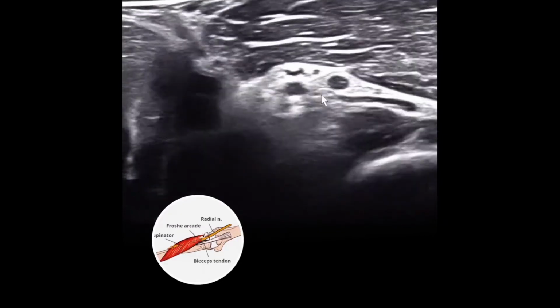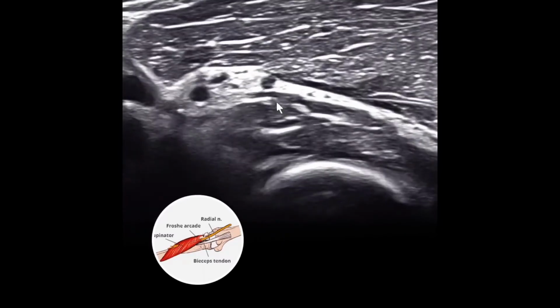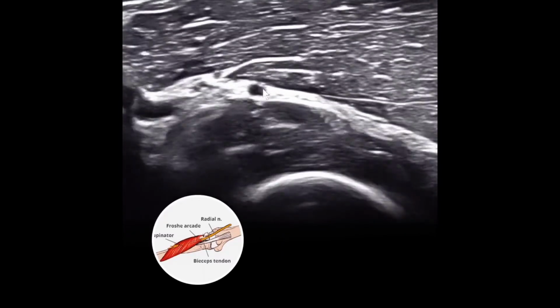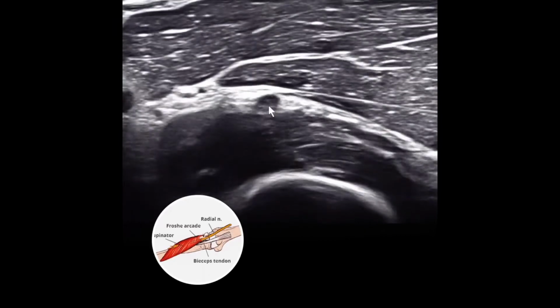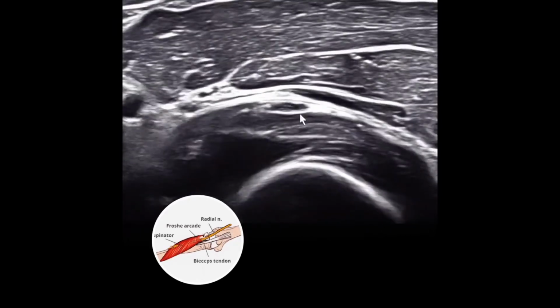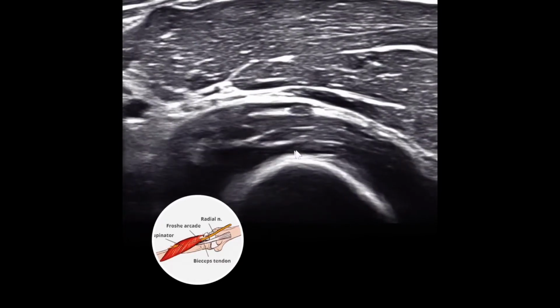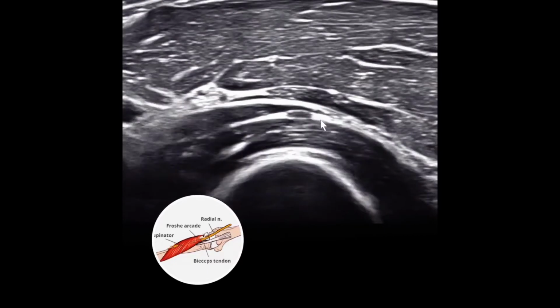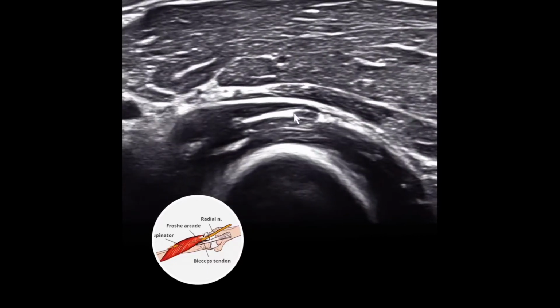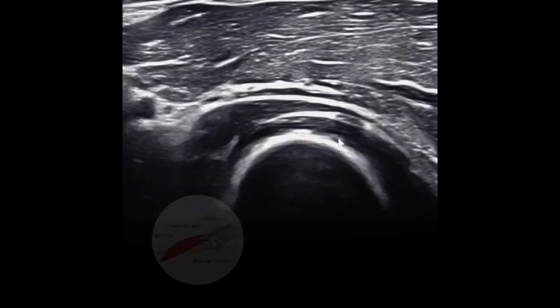So I go above, and move back, now it has to penetrate. And now watch it penetrating. See, here, boom, it's inside. It's inside. And now you could see 2 heads. Superficial, deep head of the supinator, and it travels inside, and now this becomes a radial tunnel.